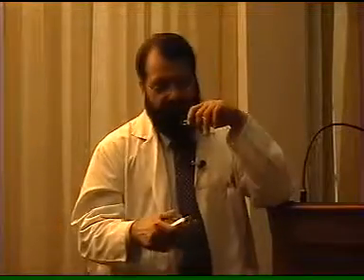Right? And then the ST segment is the segment that is between the S wave and the T wave. Usually it is isoelectric. It should be at the baseline. And the T wave is a positive deflection which represents the ventricular repolarization. So ventricular repolarization is basically the T wave.